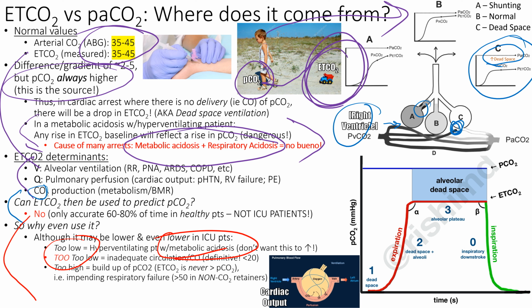So they might have a raging UTI and the bicarb's 12, and you want their end-tidal CO2 to be 28, right? You don't want that, during your shift on your next assessment, to be like 36, and then it's 42, right? So you have that trend, right? There's no reason for that to jump up like that, except for some fringe cases like a bicarb push, and we'll talk about why.